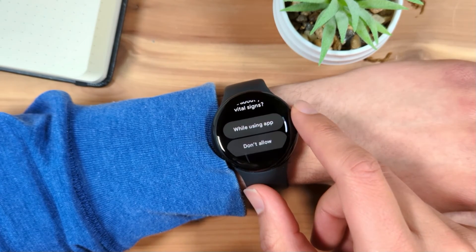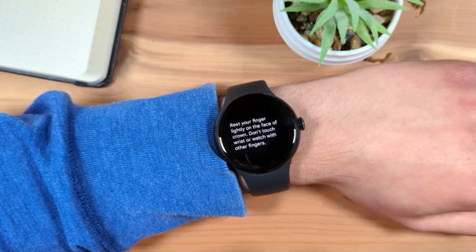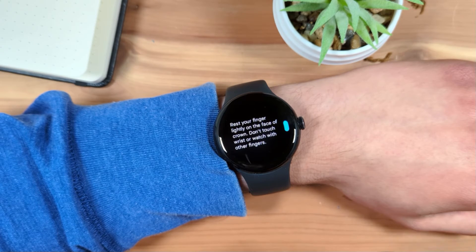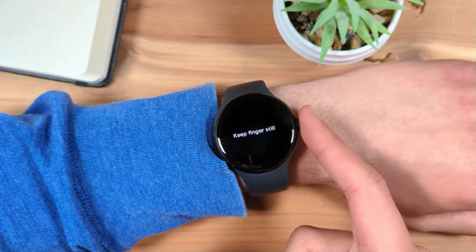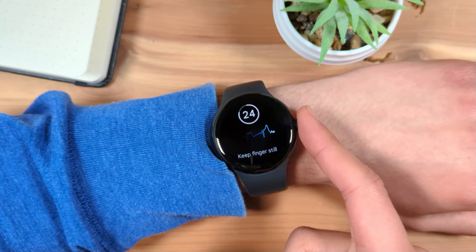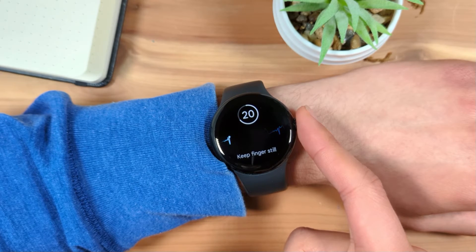If prompted, grant the ECG app access to your vital signs by selecting the button on the popup. Next, rest your finger lightly on the crown. Make sure not to touch your wrist or other fingers. Continue resting your finger on the watch's crown and stay still for the duration of the 30-second test.